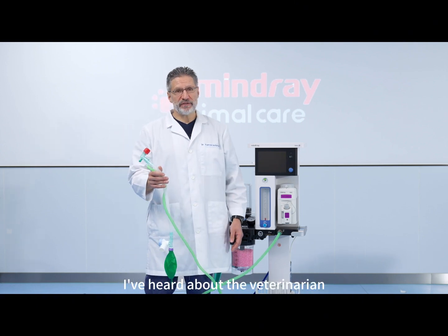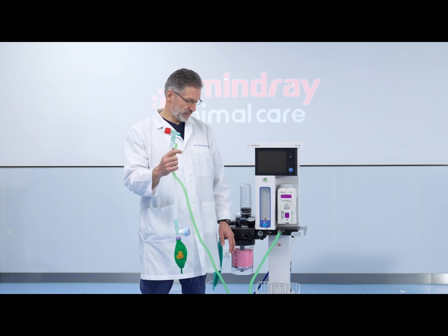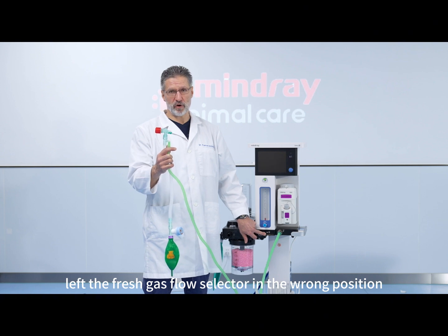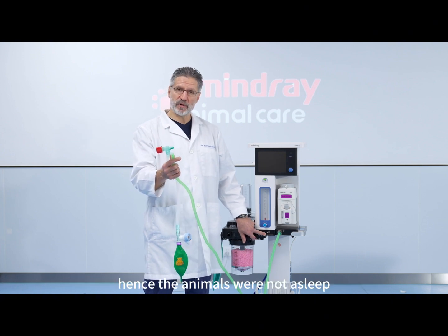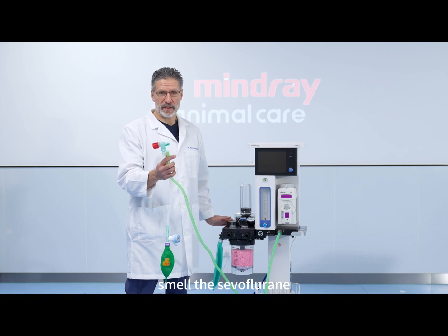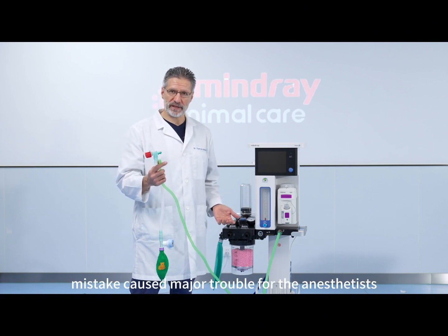I've heard about a veterinarian who was anesthetizing parrots via a non-rebreathing system and left the fresh gas flow selector in the wrong position. Hence the animals were not going to sleep and everybody in the room could smell the sevoflurane. So this seemingly small mistake caused major trouble for the anesthetist.